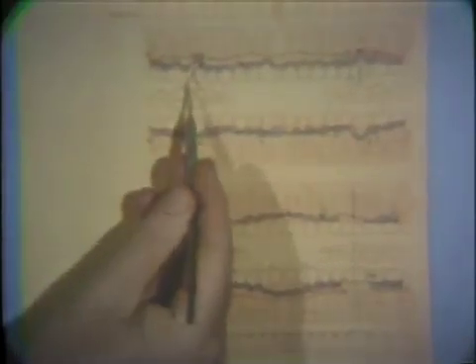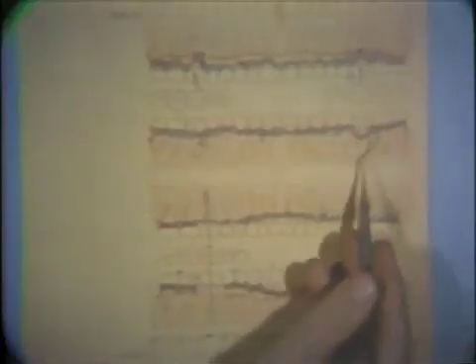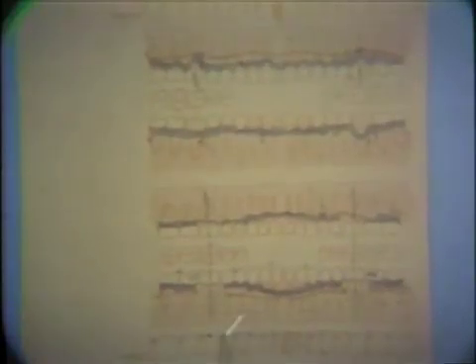Upon completion of the hygienic phase, the pockets are re-charted to determine if there is any need for surgical elimination of residual pockets. Notice that there are only a few pockets deeper than three millimeters. When the new chart is compared with the original chart, it is apparent that several of the initial pockets have been considerably reduced in depth so that they now are within physiological limits. It is also apparent that attached gingiva has been gained. For example, in the mandibular incisor region, a deformity which initially appeared to need mucogingival surgery has now been eliminated.